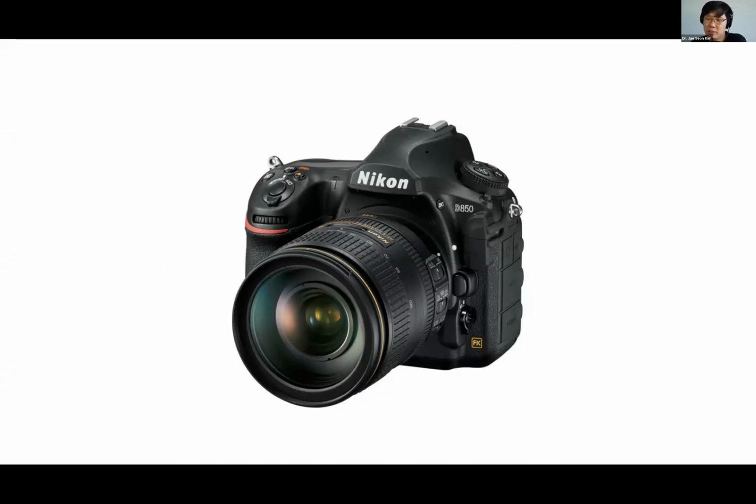They're saying that the DSLR is out of fashion and will be off the market pretty soon, which I think is not a bad thing, because the DSLR prices are going down. And the quality of pictures that you can get from a DSLR camera is plenty sufficient for our dental photography world. So I still continue to use the DSLR.